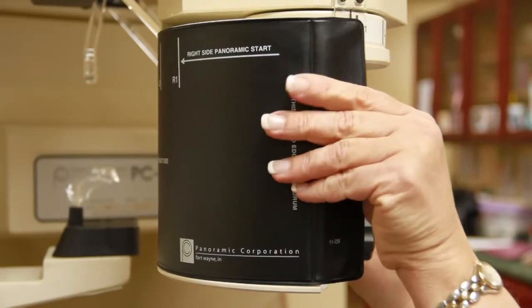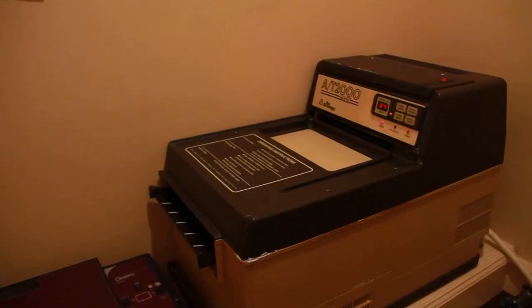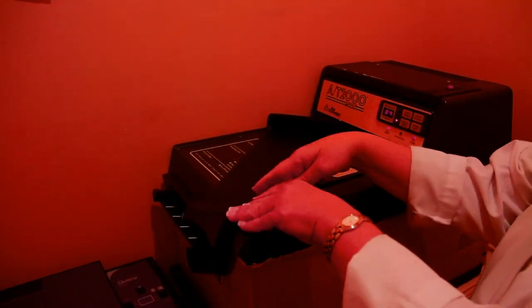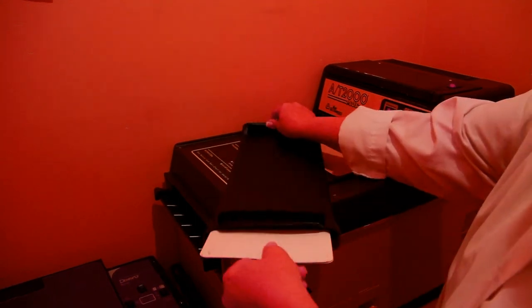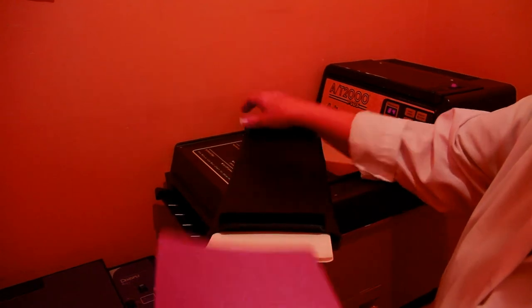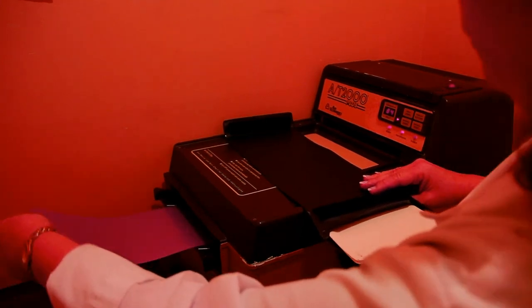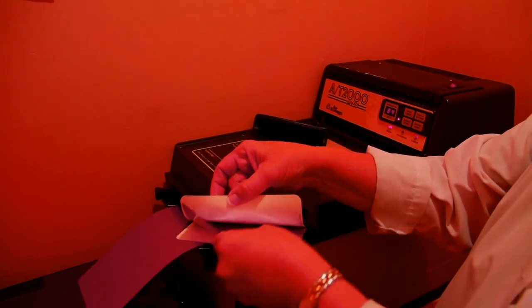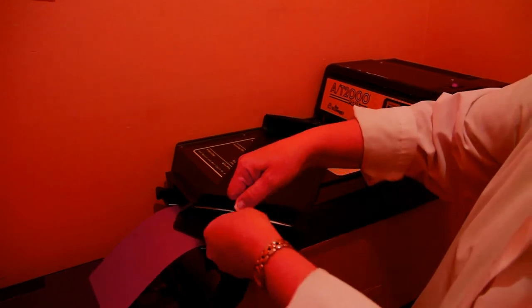Once the x-ray has completed its cycle, remove the film bag and take it to the dark room for processing. Once in the dark room, make sure you turn off the light before opening the bag. You can use the red light to see what you are doing — this red light will not interfere with the chemical exposure of the film. Take out the exposed film from the bag and feed it into the film processor as shown. While this is developing, place a new film into the bag, making sure the film is placed between the two white sleeves, and reseal the bag.